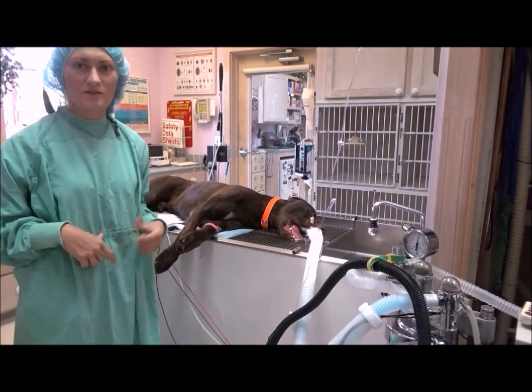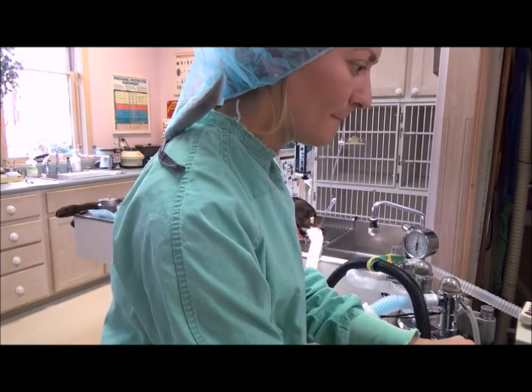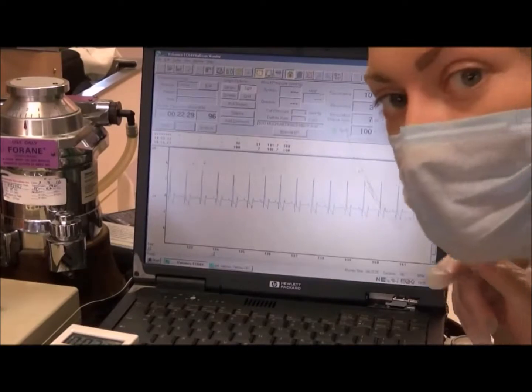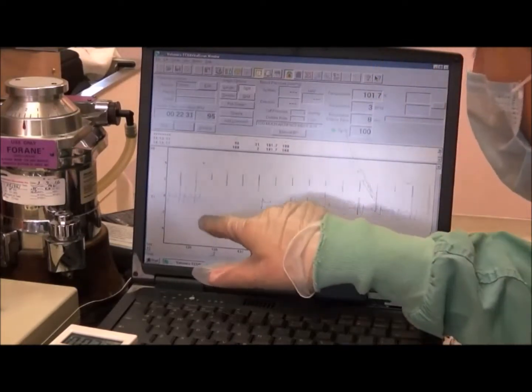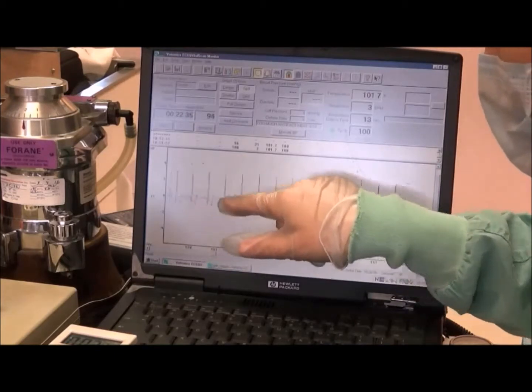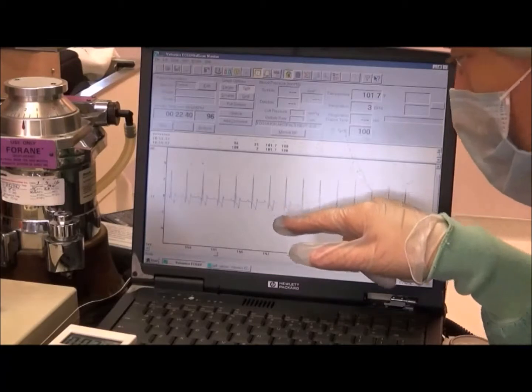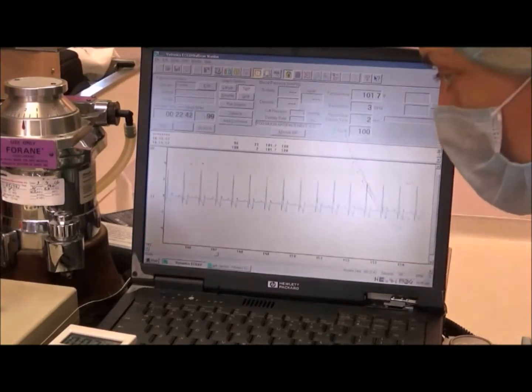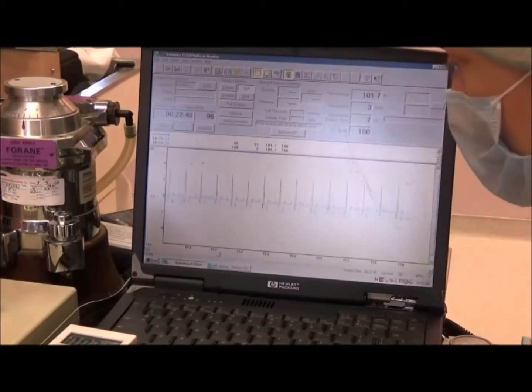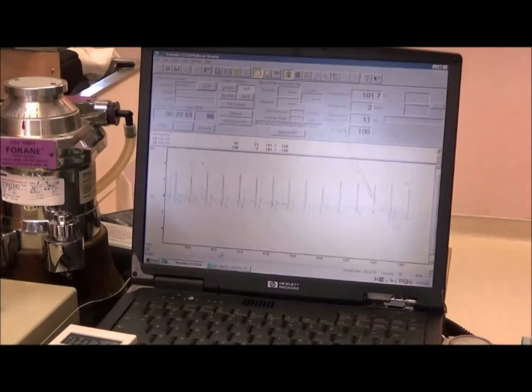And once they're moistened, you're good to start the EKG monitor. Our ECG is now going, so you can see that there's definitely the P waves, the QRS wave, and the T wave there. For the P wave, it may be a little bit prolonged. He could be experiencing first-degree AV block, but that can be normal for patients undergoing the anesthetic.